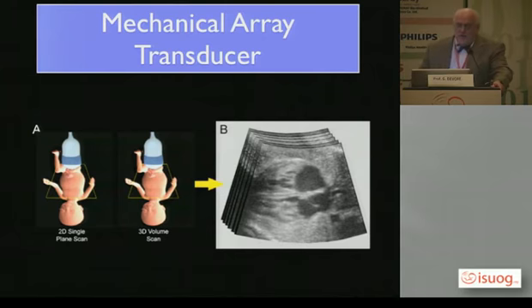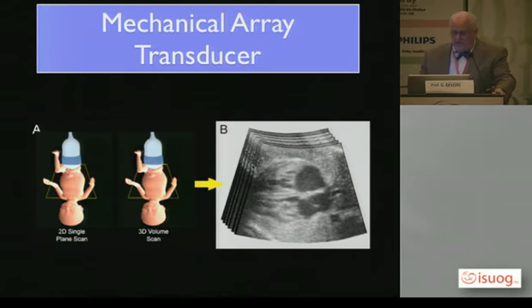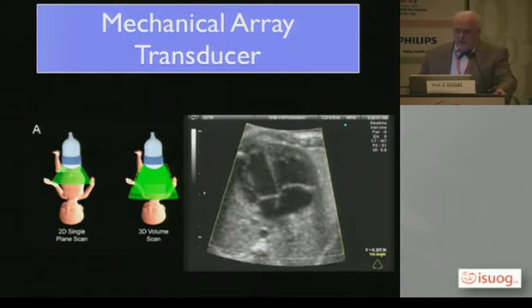When we perform a 3D ultrasound, what occurs is, first, if you're scanning, for example, a fetus with two-dimensional ultrasound, you have a plane, you place the transducer, and you have an image. And you can move that image back and forth freehand, like we would see here, for example. With this 3D volume scan, the same principle applies, except it's done mechanically, where when you push the button, the scan moves through a certain area, it collects thousands of images, and then puts those images together to create a volume. Here's an example of that.